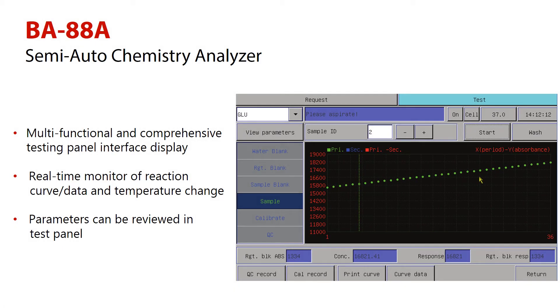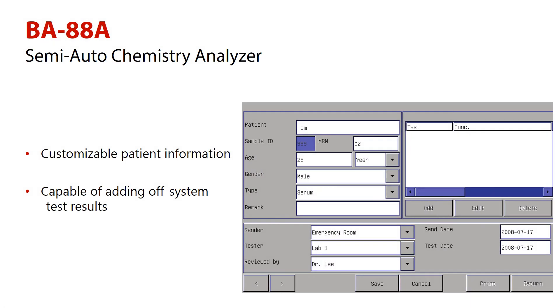The multifunctional and comprehensive testing panel interface display helps real-time monitoring of the reaction curve or data and temperature change. The patient information can be easily customized.